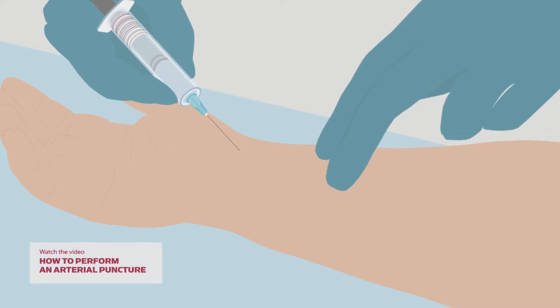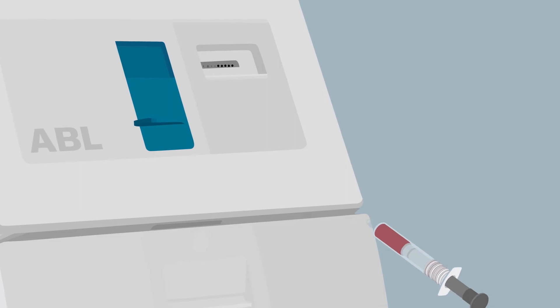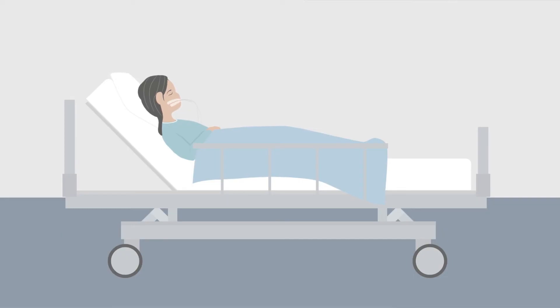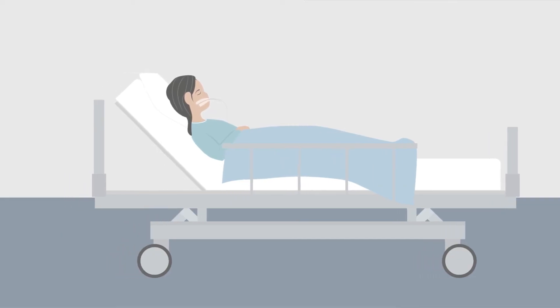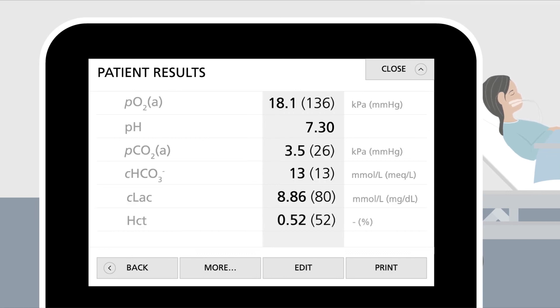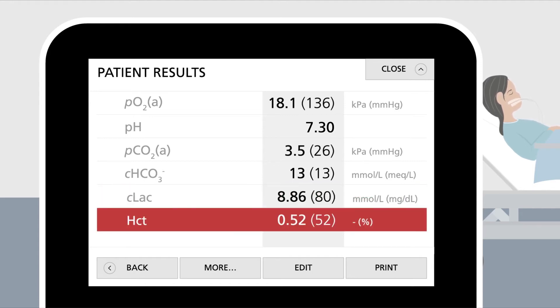A new blood gas sample is collected from an artery. You place the syringe in the inlet on your ABL analyzer, and shortly after, you receive the patient results. The results show that the ventilation is under control, but there is still circulatory instability represented by an elevated lactate level, and the hematocrit is elevated as a sign of hemoconcentration, which may be a result of a capillary leak.